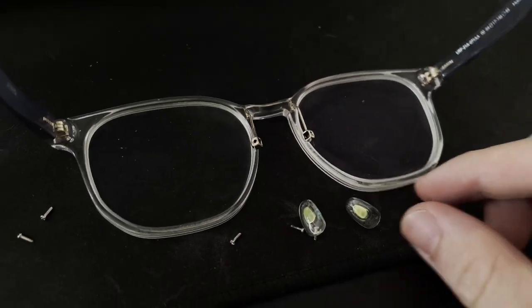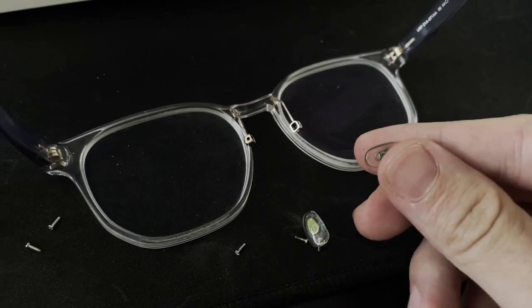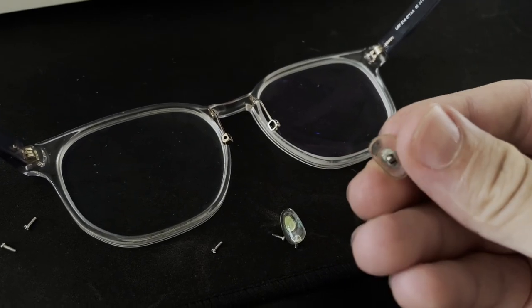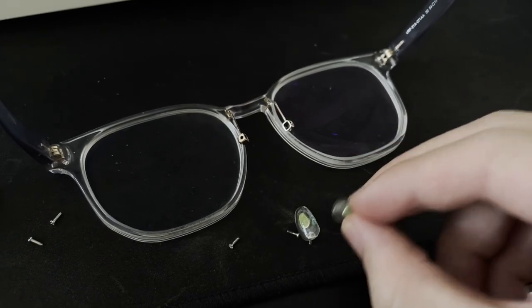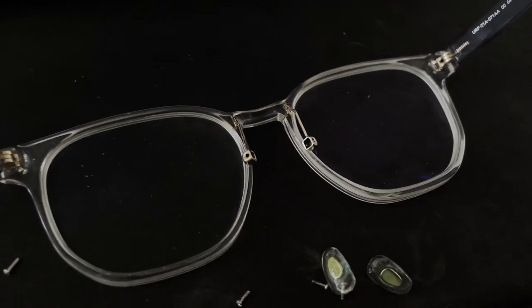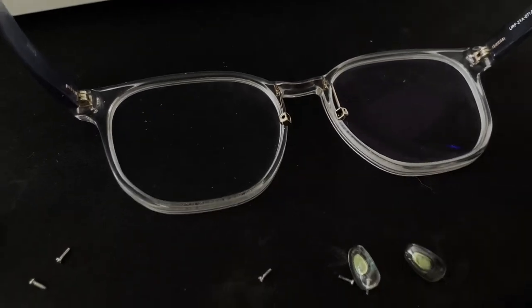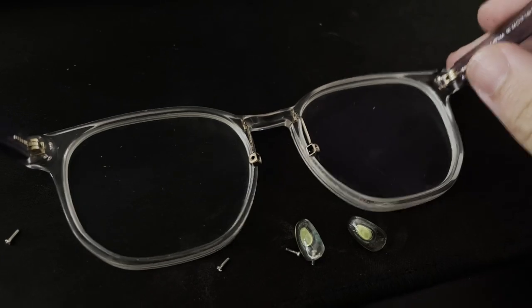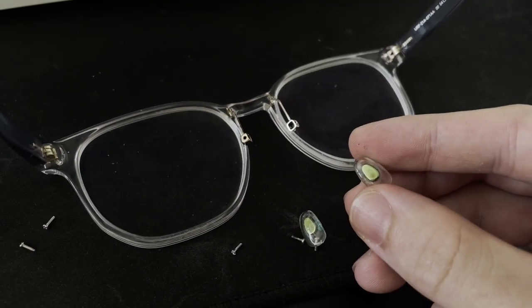I've been having this problem with my glasses for a while now where the nose pads turn green, and it's really gross. I've been searching on YouTube and online everywhere. There are some tutorials about how you can wash them, but I found it really annoying. Previously I went to the store to replace them, so they replaced them with the same nose pads, but it got green again after a short while.